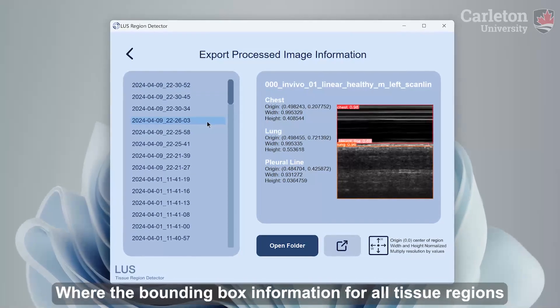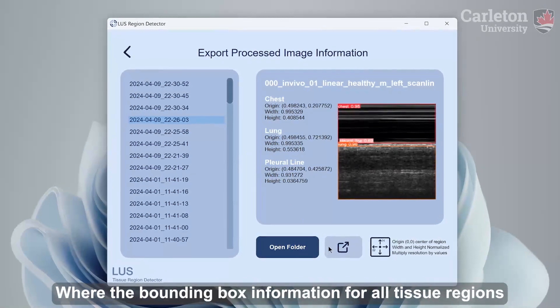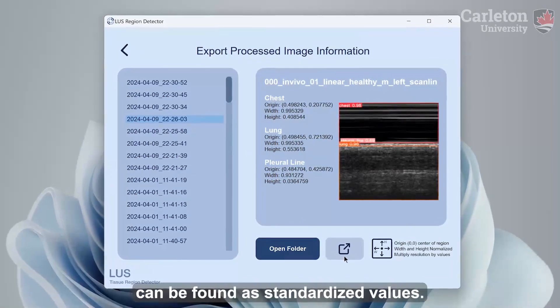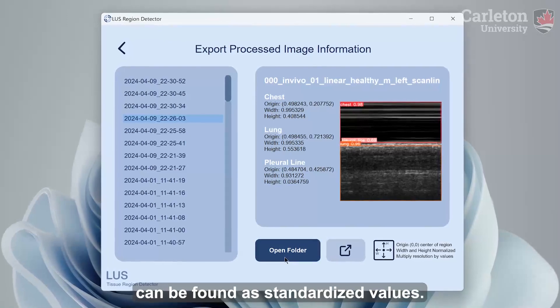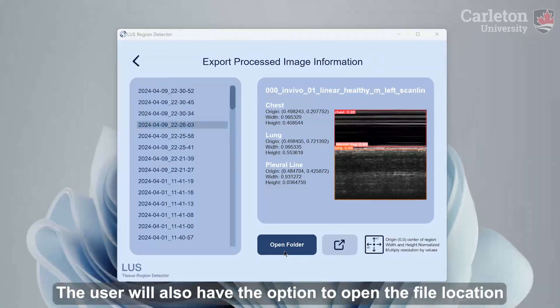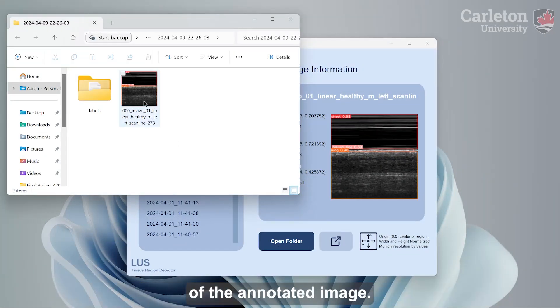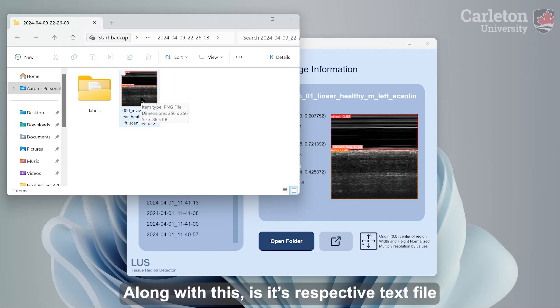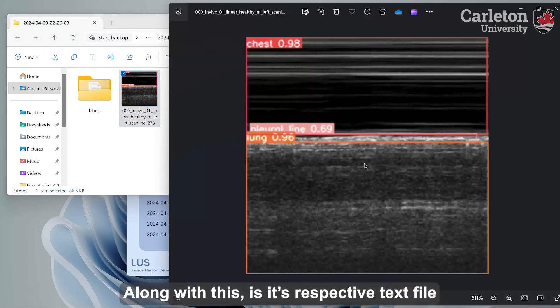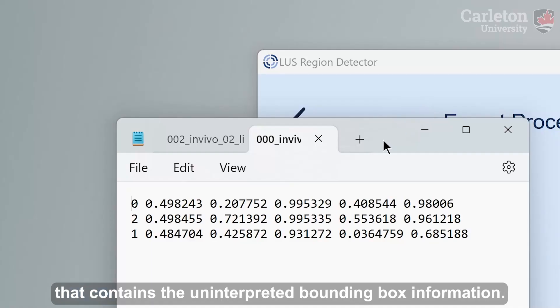Making a selection will fill in the content on the right-hand side panel, where the bounding box information for all tissue regions can be found as standardized values. The user will also have the option to open the file location of the annotated image, along with its respective text file that contains the uninterpreted bounding box information.